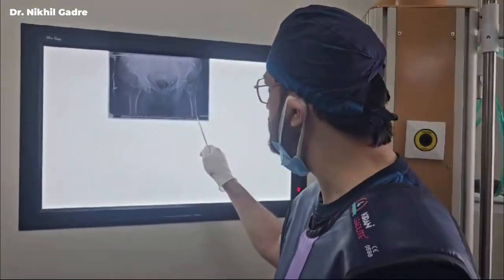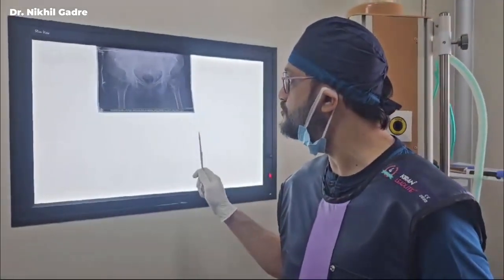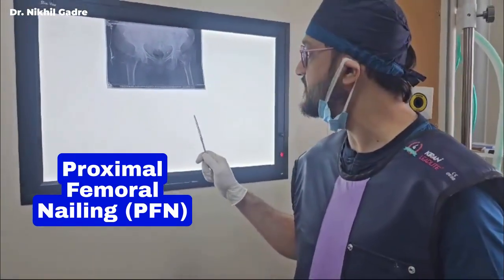As you can see, this is a type C canal. We are going to reduce it on a fracture table and do a proximal femoral nailing. Actually, trochanteric femoral nailing, 18 centimeter nail we are going to use.